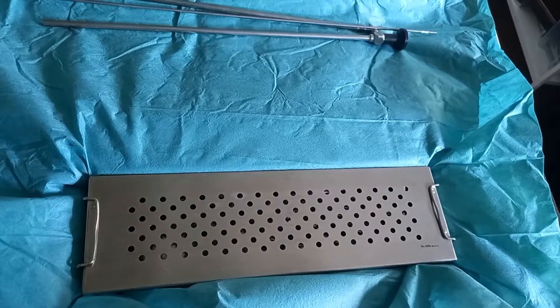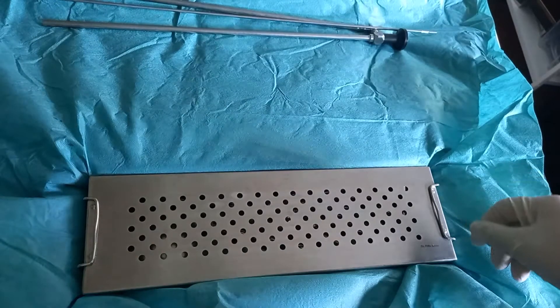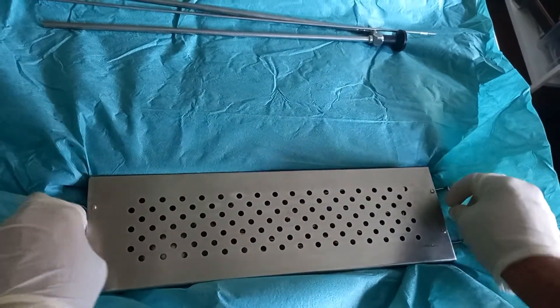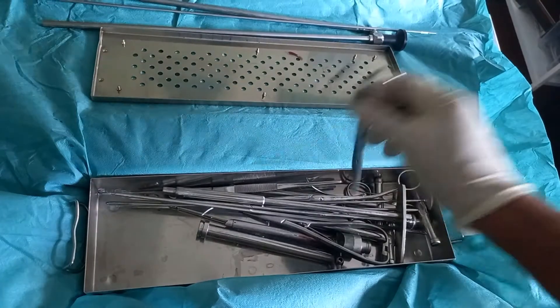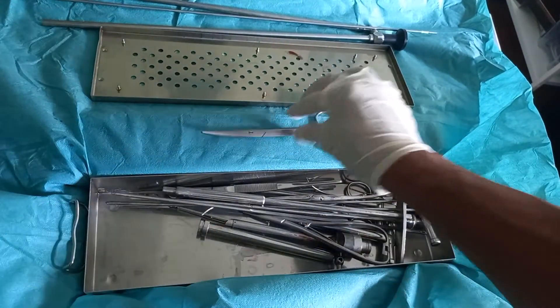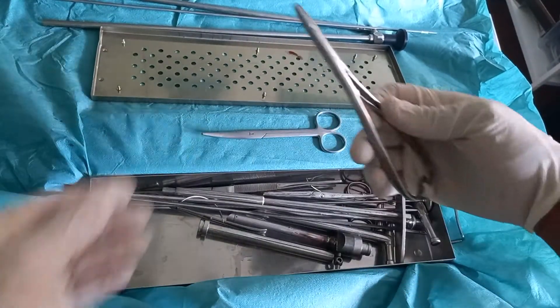In this video we will explore the contents of the operation set for abomasal displacement after Christensen. At the beginning there are some standard surgical instruments like scissors, needle holder, scalpel, and so on.